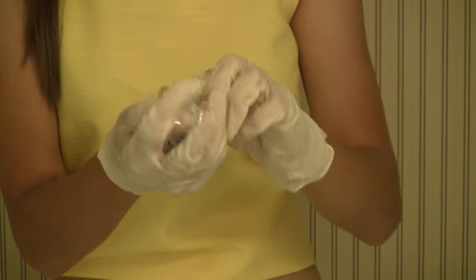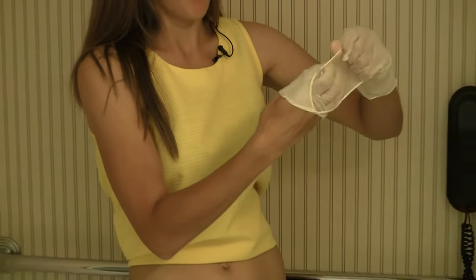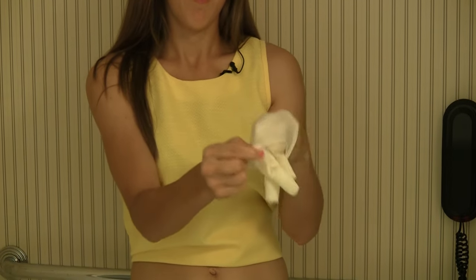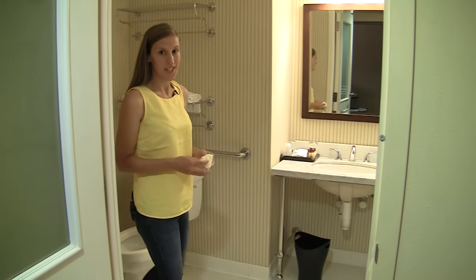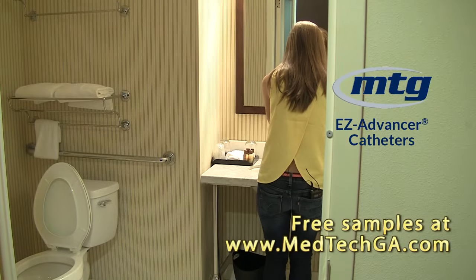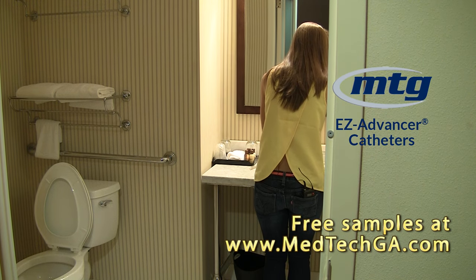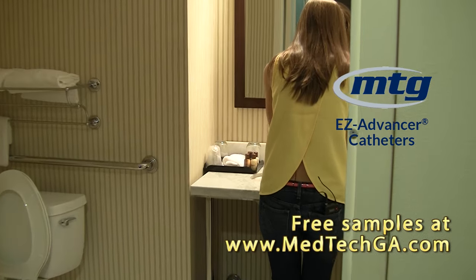To dispose of the bag, you wrap it up into a small ball in your fist. Take your first glove and wrap it halfway around, then put it in your other hand and wrap that glove around. That way you're never touching the urine. After finishing the process and disposing of the bag, I need to wash my hands again.